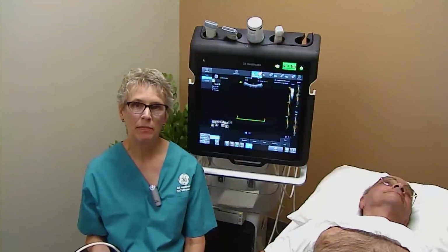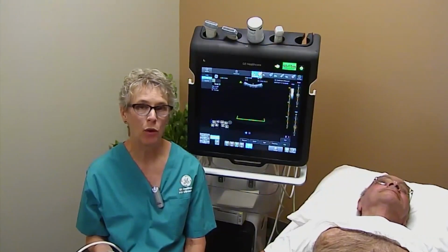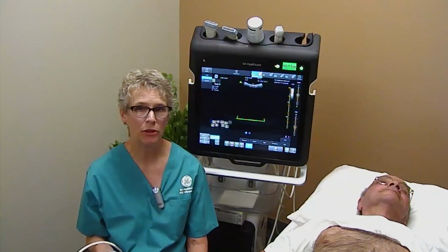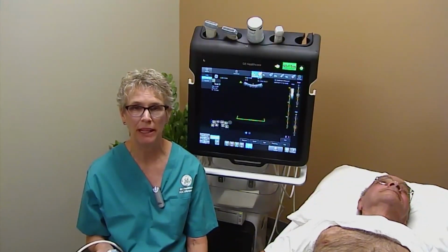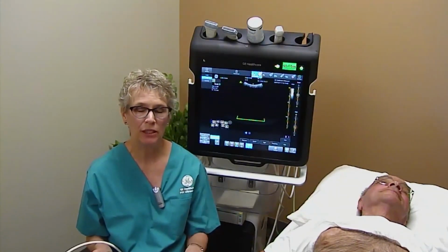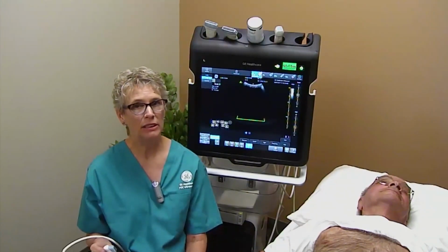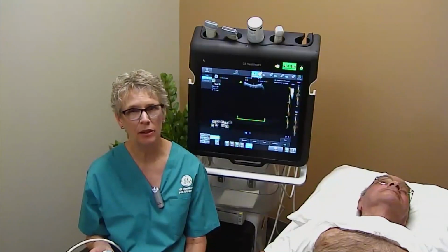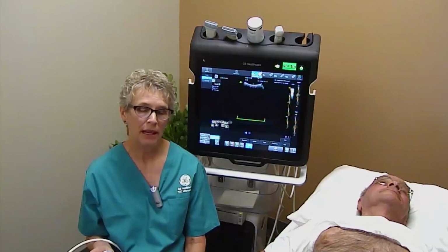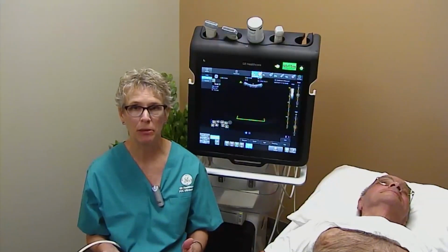Okay, now we're going to talk about two different methods of scanning the lung for B-lines. One is called the across the ribs method, and that's the most common by far. This is where you've heard me refer to the bat sign, and this was really initiated by Dr. Lichtenstein. The bat sign represents the two ribs, and then you see the lung with the pleura in between them. But there are some physicians, especially in ICU and critical care, who prefer to scan along the ribs. What I mean by that is that they're not showing the ribs at all, they're just showing a long image of the pleura.